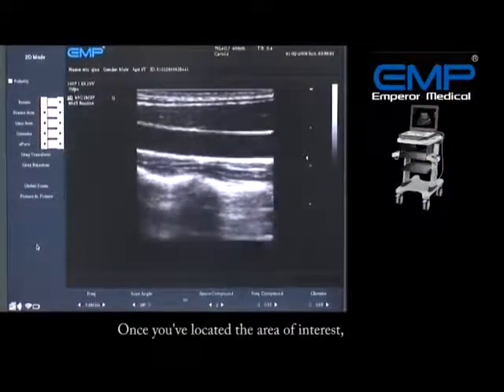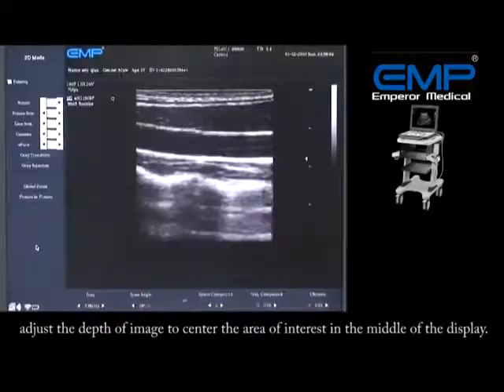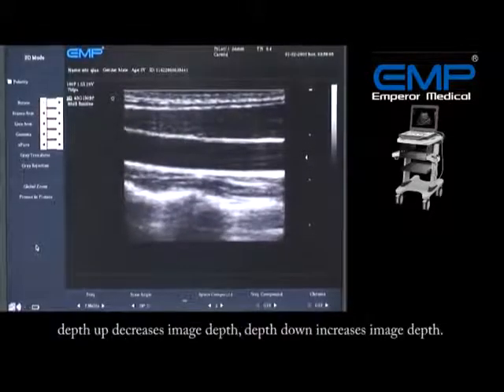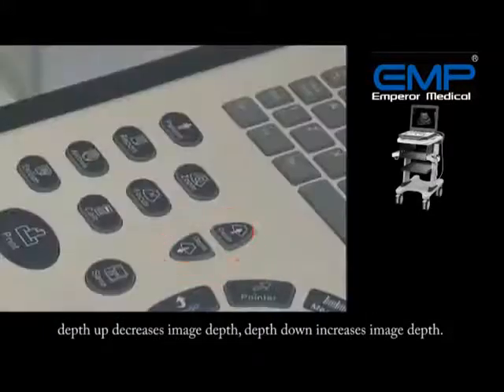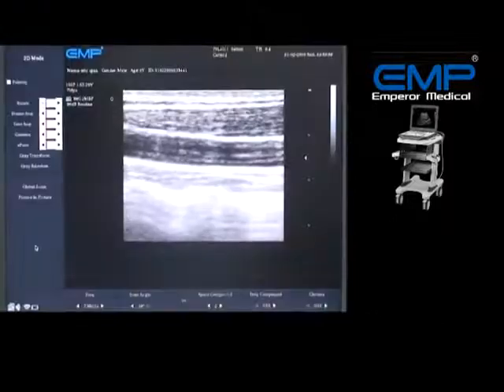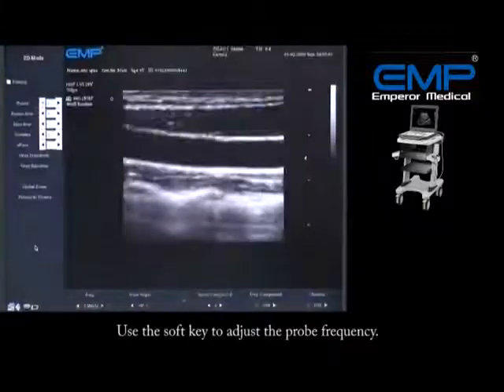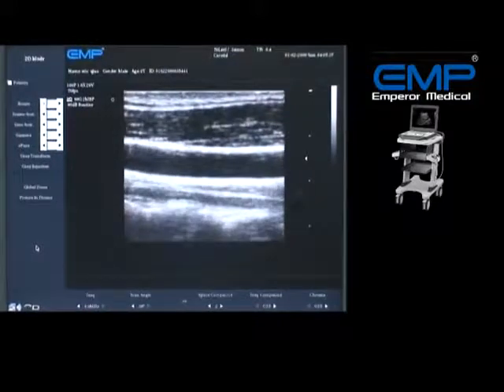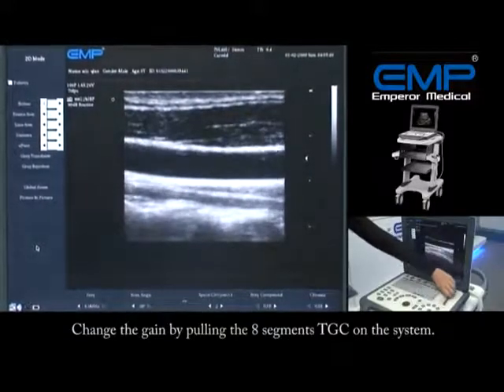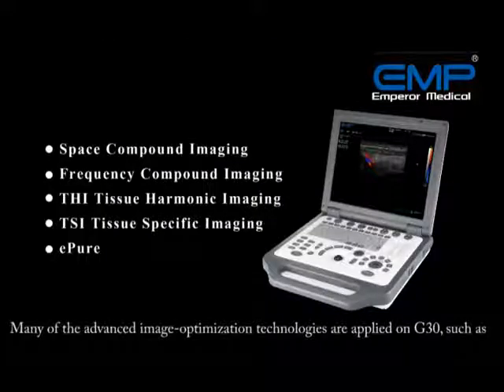Once you've located the area of interest, adjust the depth of the image to center it in the middle of the display. Depth Up decreases image depth; Depth Down increases image depth. Use the soft key to adjust the probe frequency. Change the gain by pulling the 8-segment TGC on the system.